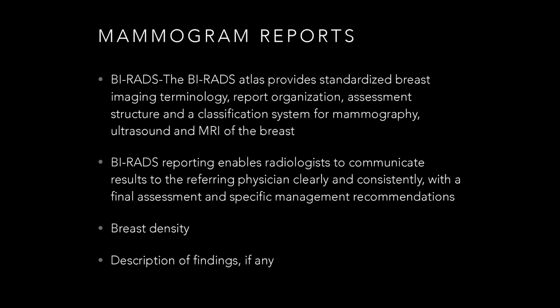Okay, so in a mammogram report, the most important information is we're going to have a BI-RADS. That's a standardized terminology that is used in breast reporting that enables us to communicate the results and what should be done about the results. We're also going to talk about breast density and then describe any findings if there are any.